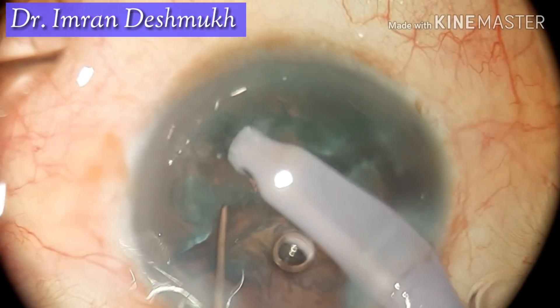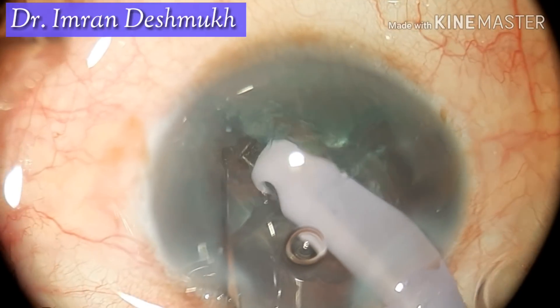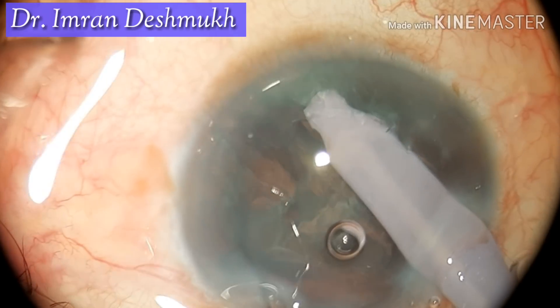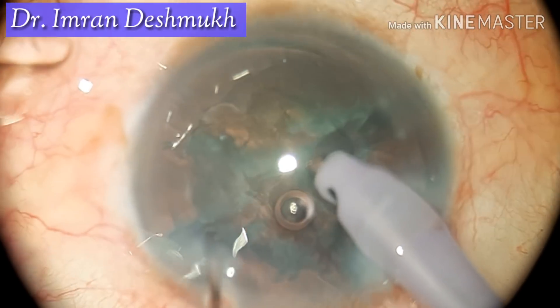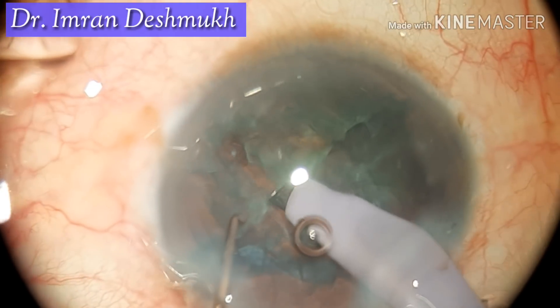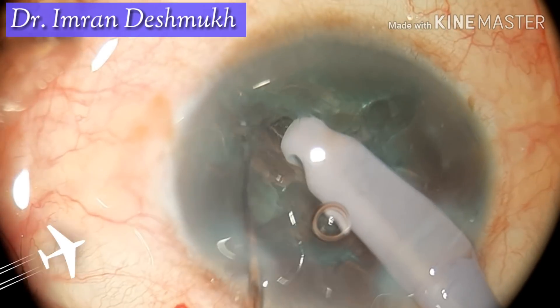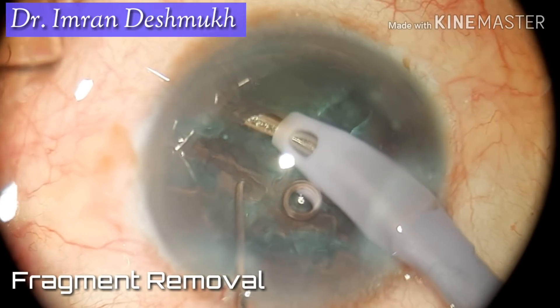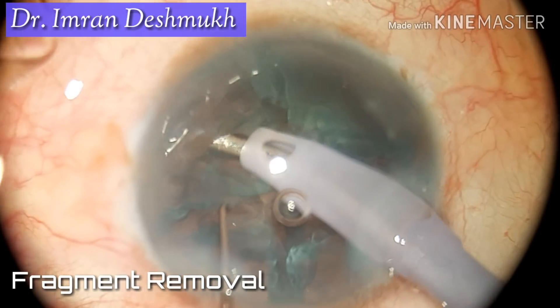Now I trench the other half — don't go too deep. After trenching, I put both instruments in and try to divide. Again I don't have a complete divide; it's a partial divide. For the remaining half of the nucleus, slowly trench, reach the desired depth, put both instruments in, and divide. You want to make four pieces — like pieces of pizza.